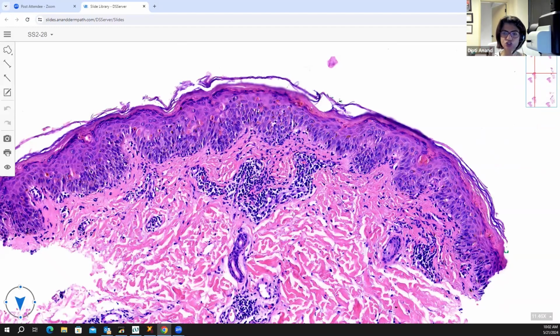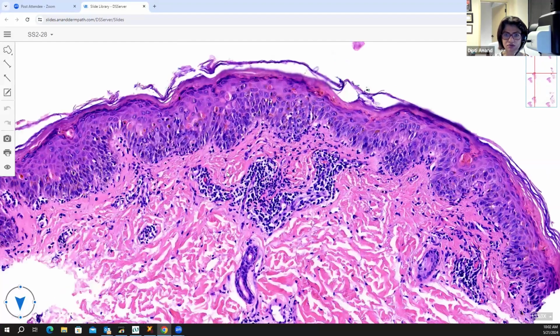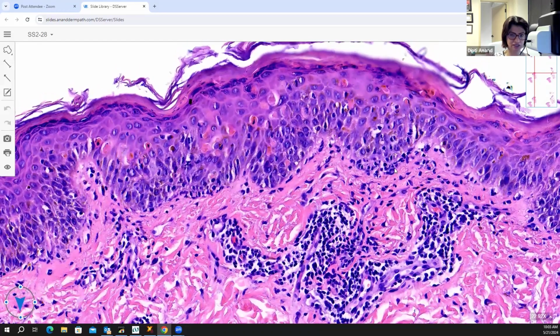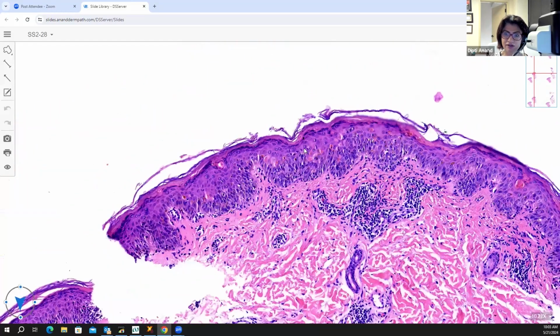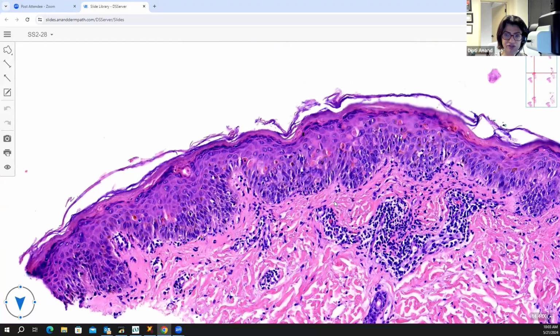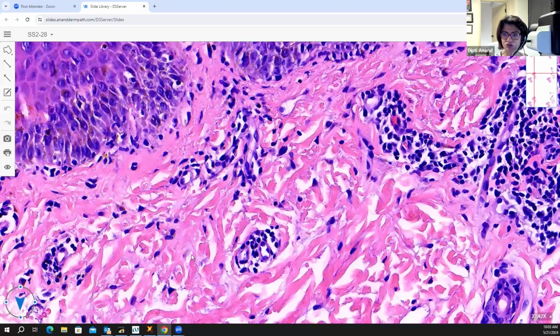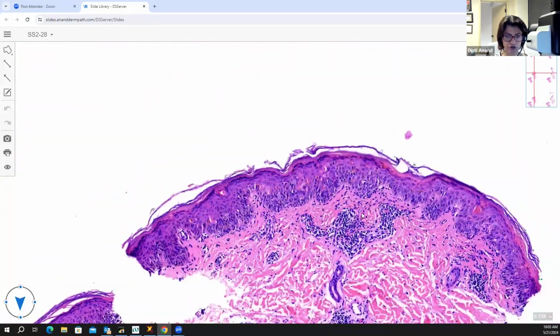Okay. And you know what? If the pattern confuses you, look again at the recognition of the necrotics. You see how they go up, down, up, down. Lupus produces vacuolar change, but it doesn't produce this much necrosis. That's also indicative of acute if you are getting confused. Plus the stratum corneum here is basket weave. And you can clearly see the pigment dropout and the eosinophils. So this is fixed drug eruption.